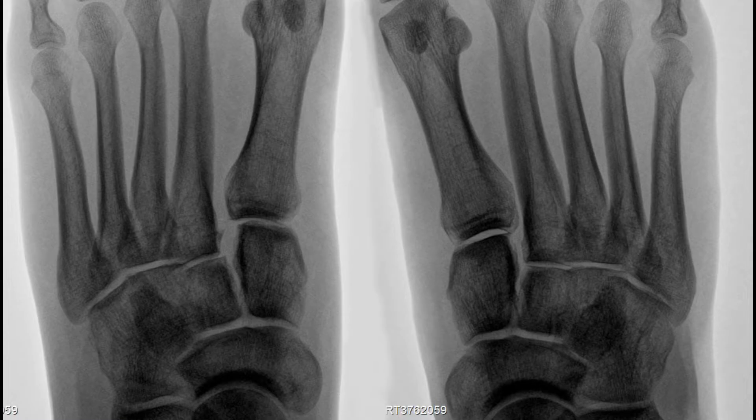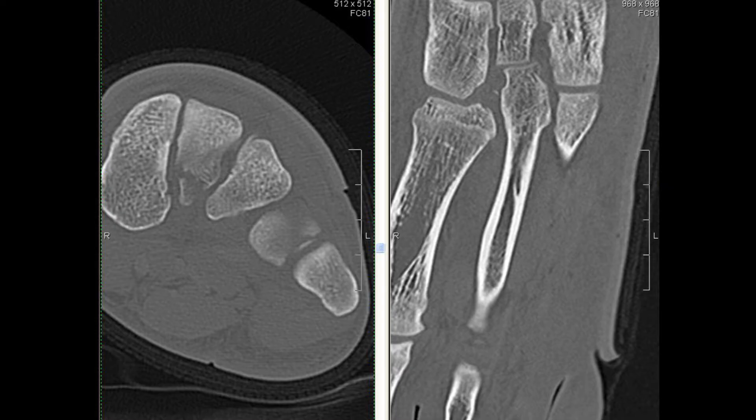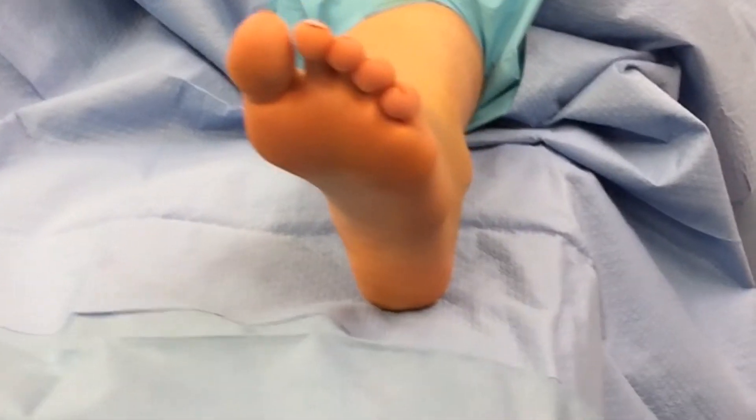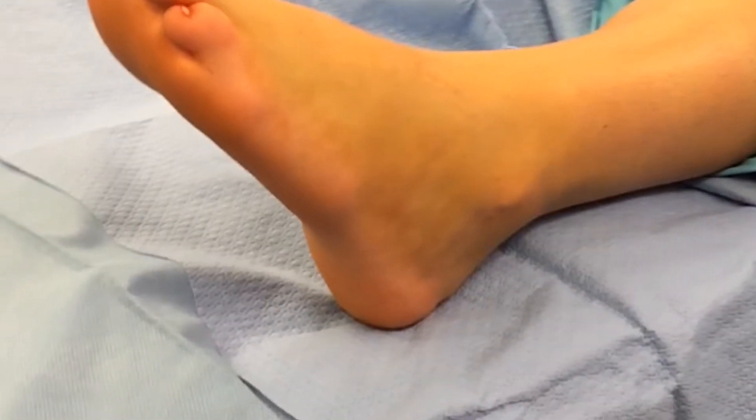A 20-year-old female who sustained a twisting axial load injury to her left foot playing soccer. Radiographs and CAT scans show a Lisfranc injury with a fracture at the base of the second metatarsal. Clinical evaluation reveals contusion over the plantar aspect of her foot.